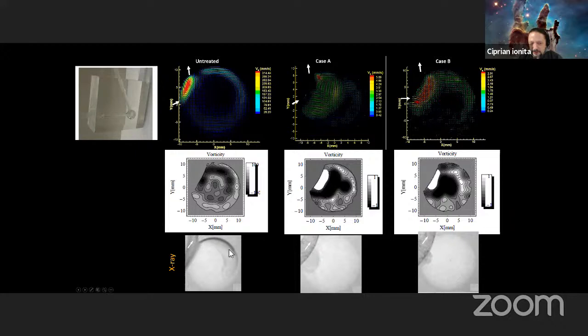The flow is from down up. You see the vortex, and then it goes from here. And again, you see it comes at the neck, goes out, comes at the neck and goes out, not quite like here. And here you see it goes right at the neck, sips in and goes out, exactly the same. So the key point that I want to make is that yes, the contrast follows the hemodynamics up to a certain degree. So when we look at the contrast flow, we can trust it. We can trust that the patterns that we actually see are related to the hemodynamics and the hemodynamic changes that come into the flow.